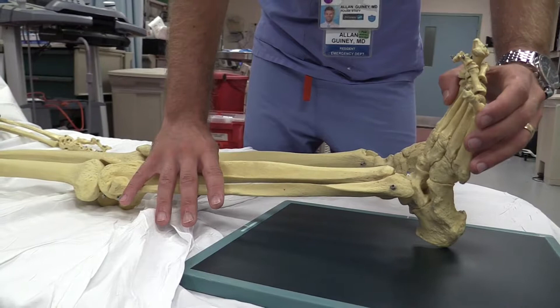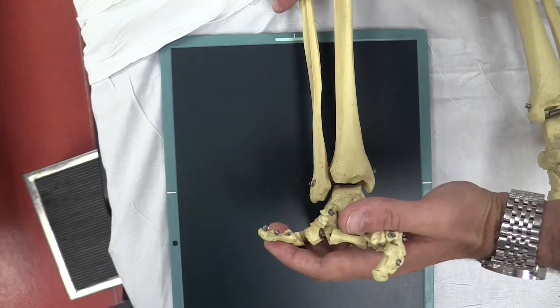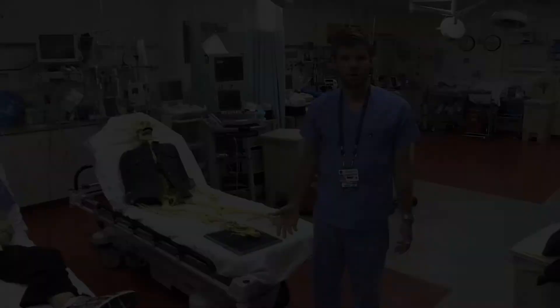Next, you need to dorsiflex the foot up. And finally, you need to externally rotate the foot while maintaining that internal rotation of the leg. As you can see, this kind of motion is going to exacerbate any underlying instability of the mortise joint.